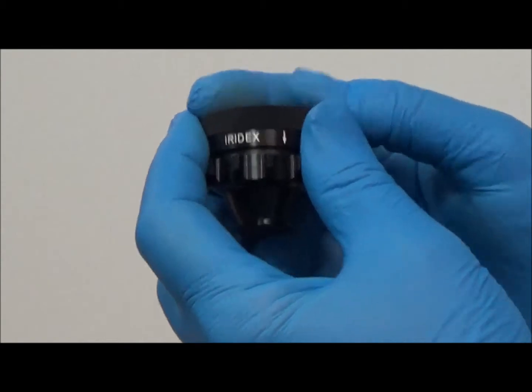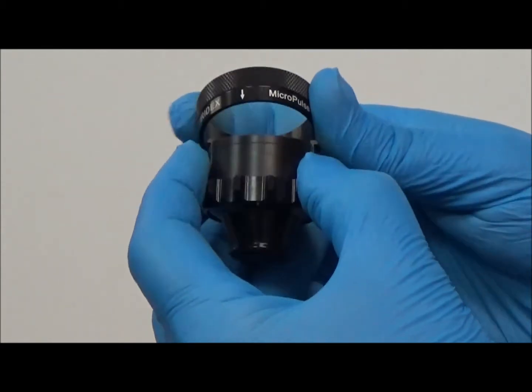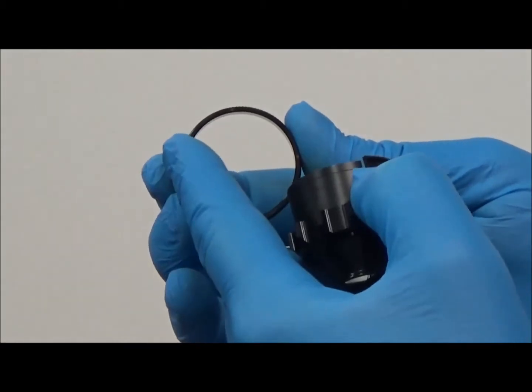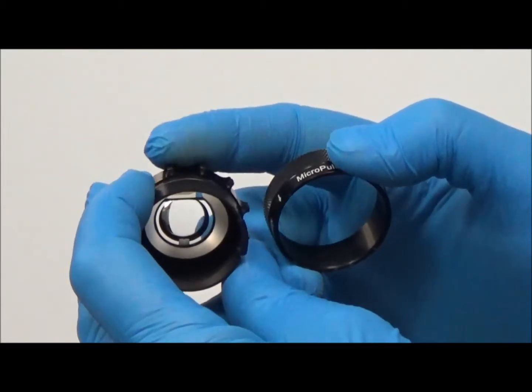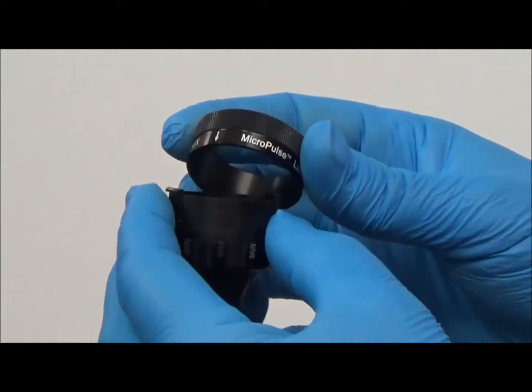With the rim removed, the indexing magnets can easily be seen. The number and position of the magnets define the rotational indexing stops, or clicks, that can be felt when rotating the lens.